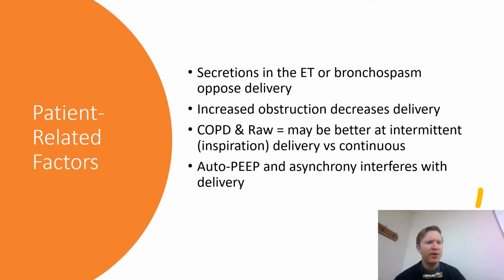So when you're nebulizing something, what happens to all that medication that's nebulizing when they're exhaling? It gets wasted. It goes to the expiratory side of the circuit. It doesn't go to the patient. They don't get the benefit of that. So therefore, what really happens with this patient? Are they getting as much medication as they should? No, because their expiratory time constant is pretty long.